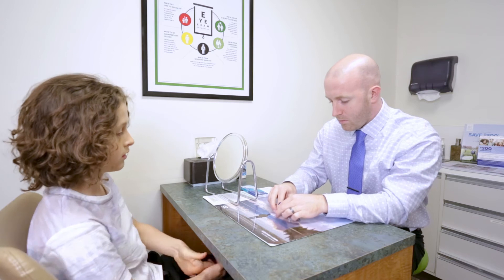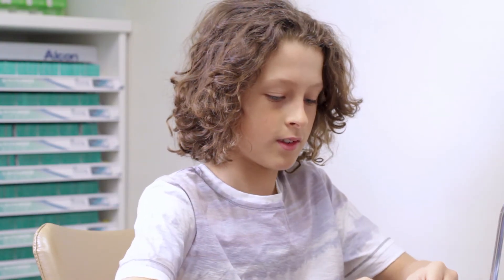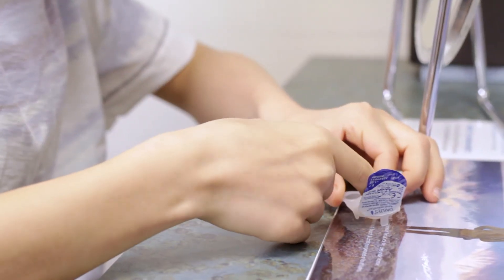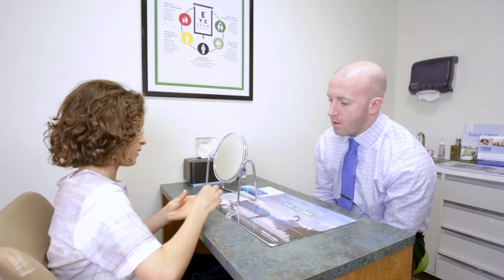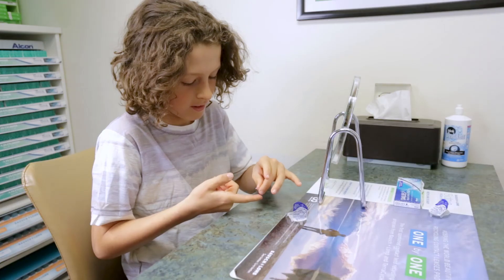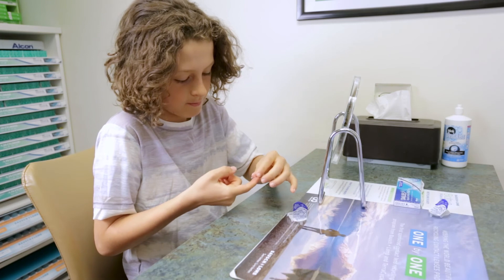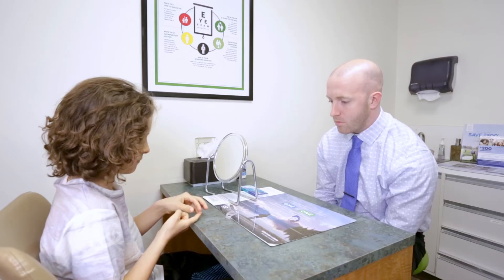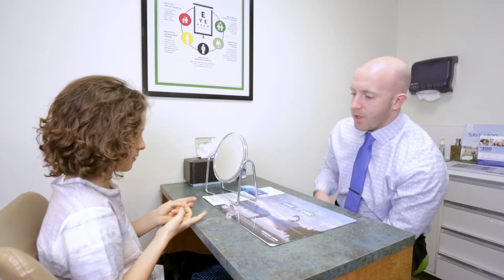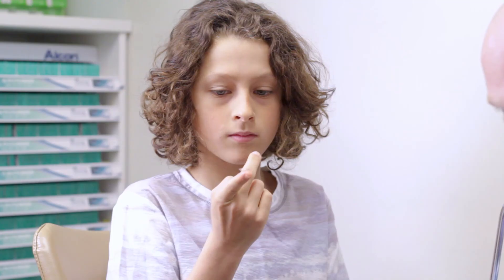I'm gonna put this back in the little pack and let you start just like you would in the morning. Go ahead and put your contact right on that finger. Make sure all those edges are up so it comes off the hand a little bit easier. Then hold it up to the light and make sure there is nothing wrong with the contact before it goes in the eye.